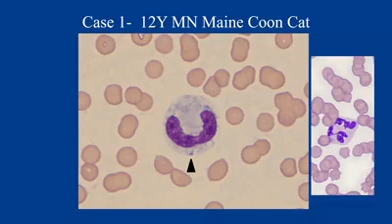It is important to be aware that in cats, small numbers of Döhle bodies can be okay, and actually the longer blood sits in a tube, so even during transit to a reference lab, Döhle bodies can start to form on their own. But because we've got other indicators of toxic change here, I think these Döhle bodies are consistent with toxic change in this patient, okay?